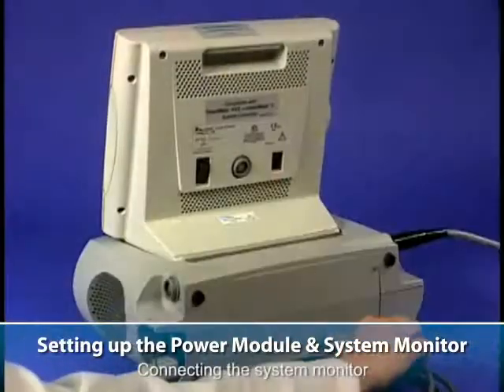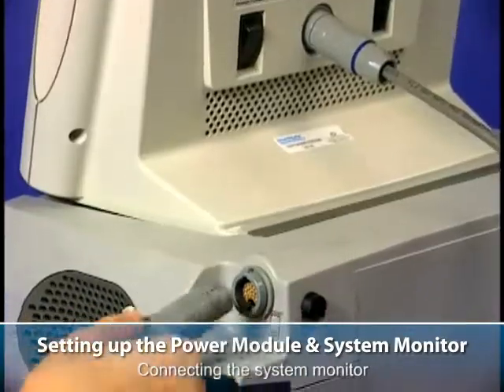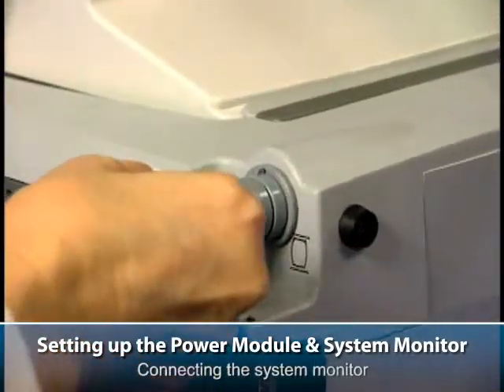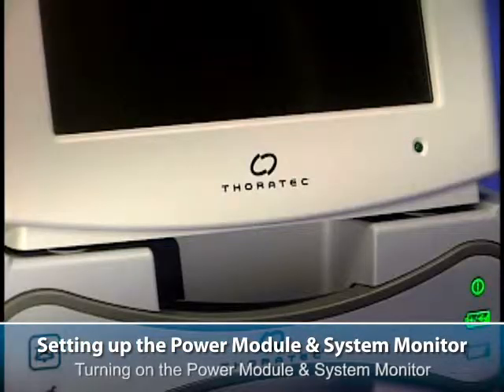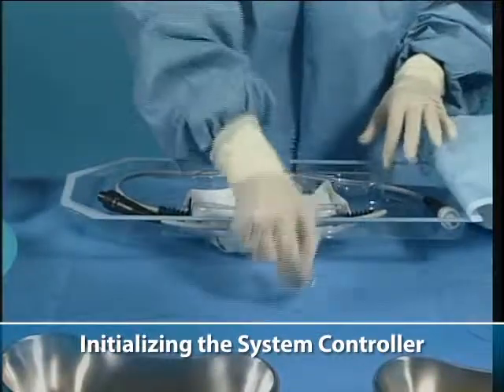Connecting the system monitor. Turning on the power module and system monitor. Initializing the system controller.